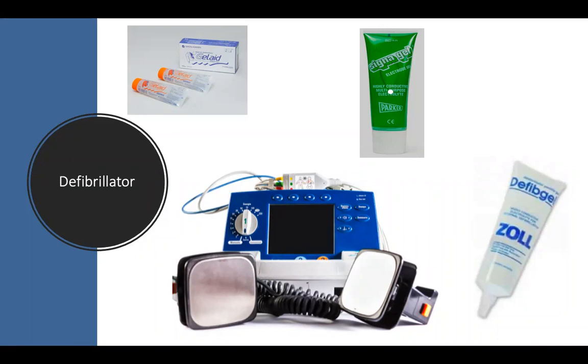All you need to do with your defib is to check whether it can charge and discharge. That's the most important thing, if you need to use it. If it's got pacing function, you need to just make sure that you've got pacing pads and that function is working. So the most times we're going to use a defibrillator is either to shock a patient, to cardiovert a patient, or to pace a patient. And checking all those things will not even take you more than a minute.